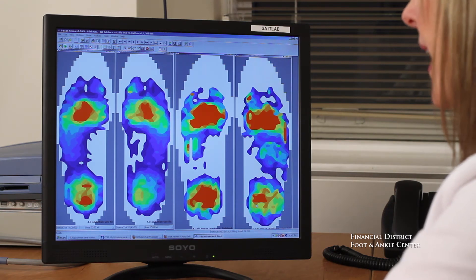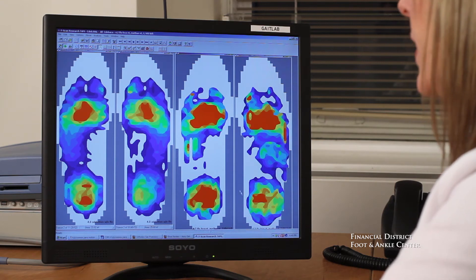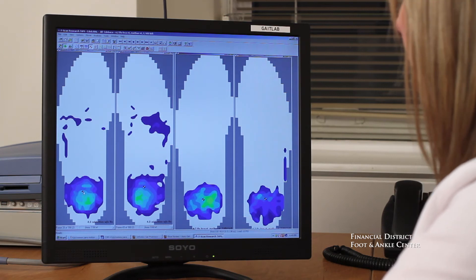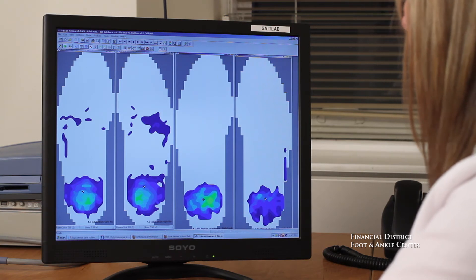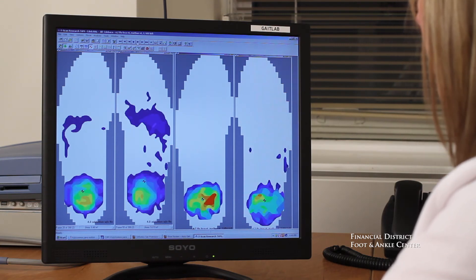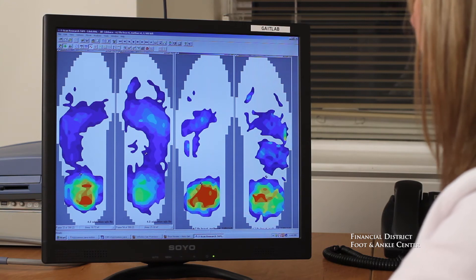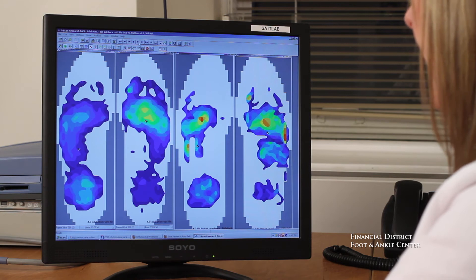The great thing about the F-Scan is we have real-time measuring of any variables we choose. The other measurement that the F-Scan can teach us is timing. Just like wheels on a car, the timing of the left foot and the right foot should travel up through the foot symmetrically. If we compare the timing of the before on the left to the after on the right, you can see the right foot is going much faster than the left foot. This results in breakdown, pain, and trauma.